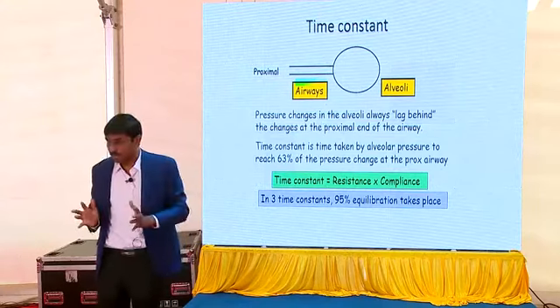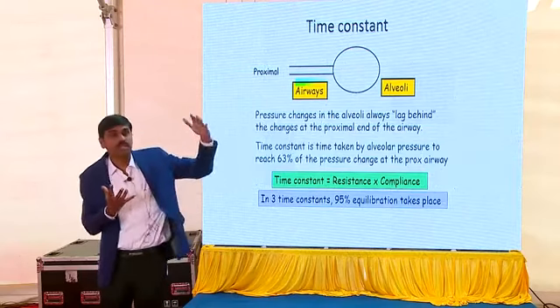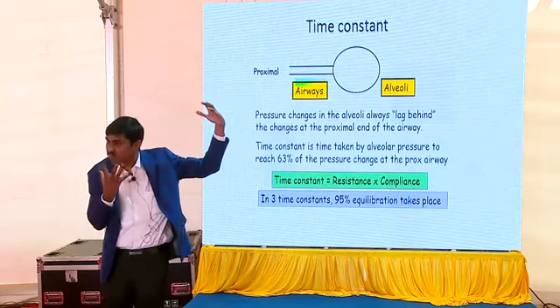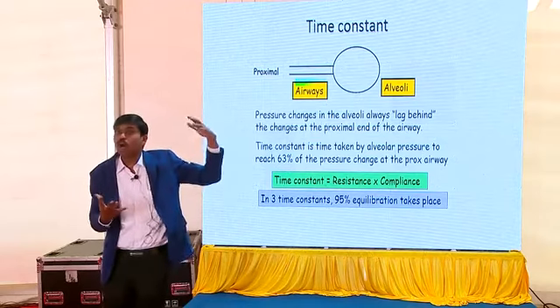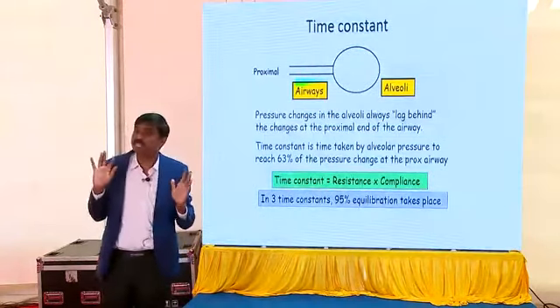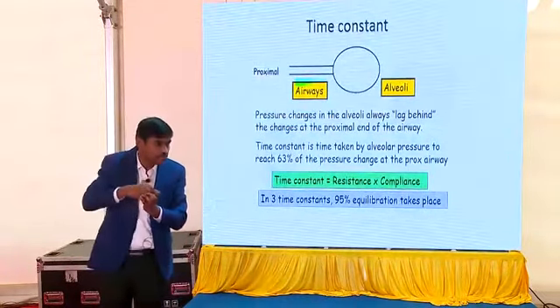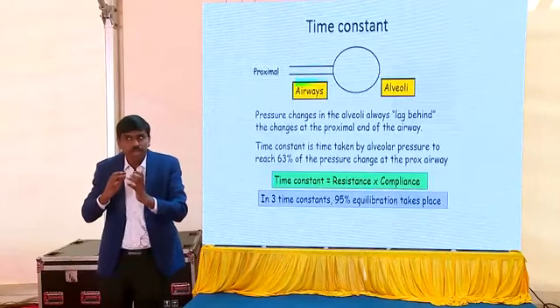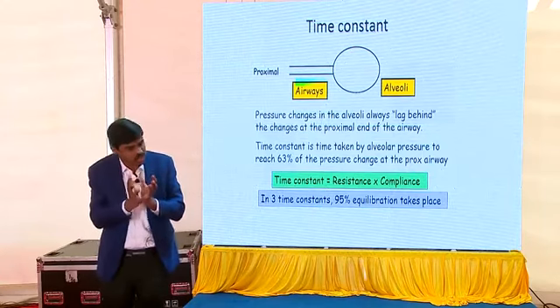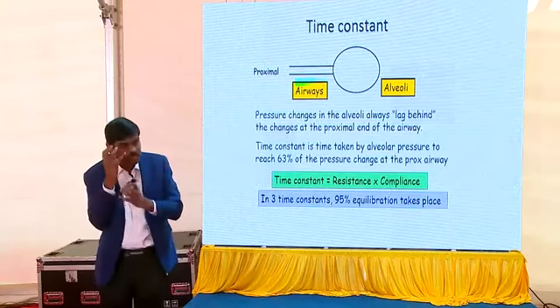Now imagine you've got a very hard lung, an iron lung. As gas starts flowing from outside and coming inside, it is very stiff. How long does it take for the pressures inside to build up? Is it more or is it less? Imagine it's very hard here. Air starts flowing slowly inside. Anybody? You've got a very hard lung, so even a little air builds pressure. Now, if it's very soft, it keeps on expanding for a long time, so your pressure builds up slowly, whereas if it's already very hard, the pressure builds up quickly.